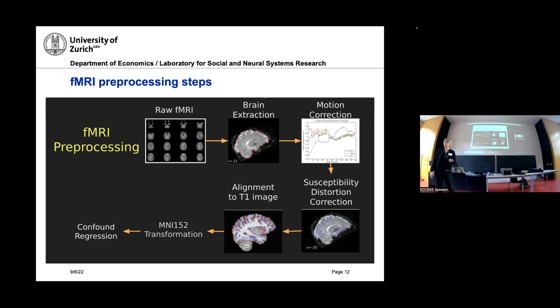The second thing is, as I told you, with these fMRI data, every two seconds a new volume is acquired. And this is on a range from a few minutes to, yeah, a good experiment 30 minutes, bad experiments an hour. The participants are lying in the scanner for this whole time, and you can imagine they are not able to not move at all during that time.